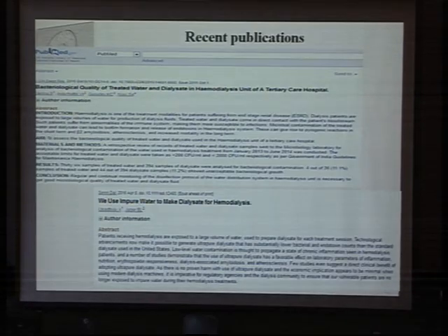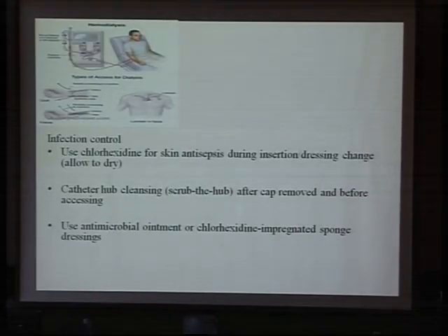There is a publication, as I told, every day they have a publication about the testing of the dialysate and what the common bacteria are. Now the ultrapure water is the best one to have for the dialysate machine, but again it depends on the finance. We can use the ordinary method and do monthly testing for microbiology identification.